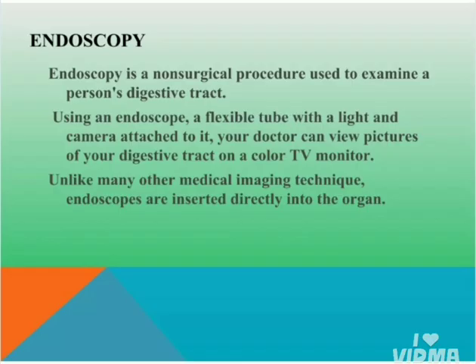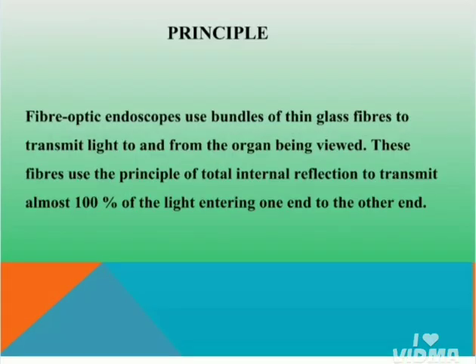Unlike many other medical imaging techniques, endoscopes are inserted directly into the organ. In principle, fiber optic endoscopes use a bundle of thin glass fibers to transmit light to and from the organ being viewed. These fibers use the principle of total internal reflection to transmit almost 100% of light entering at one end to the other end.